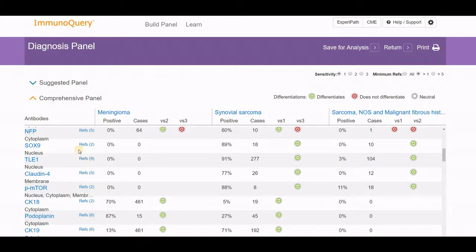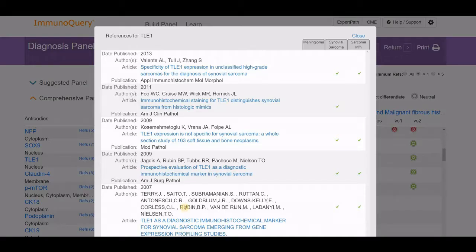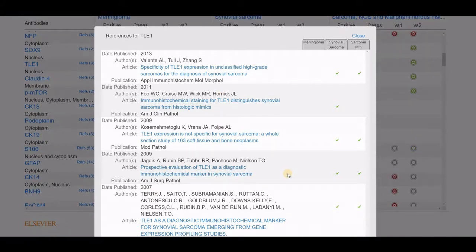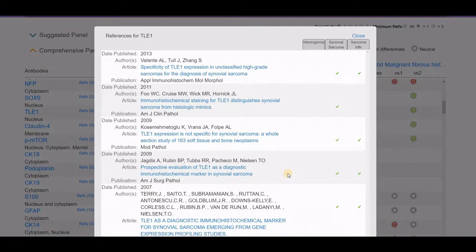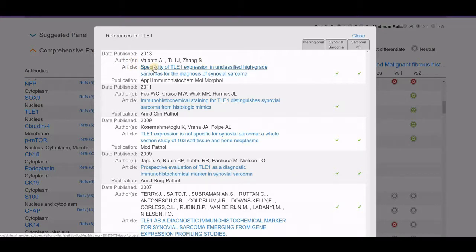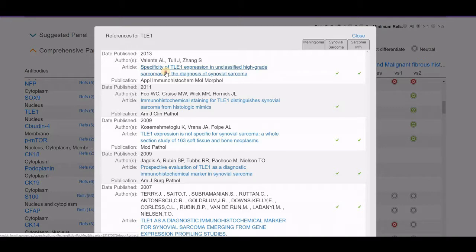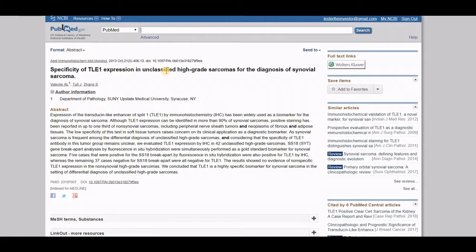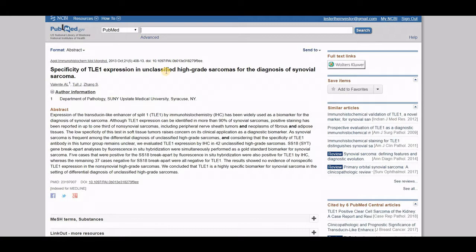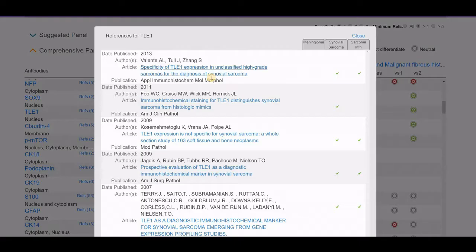You'll notice there are references listed for TLE-1. There are 91% of cases and 277 have been tested. If you click on the reference function, it brings up all references that may be valuable. When you hover over it, it highlights that finding. You can click on this reference, which takes you directly into PubMed and allows you to look at that source to confirm the findings. This is one way to trust but verify, where you're allowed to go and look at the supporting literature and use that in your findings.